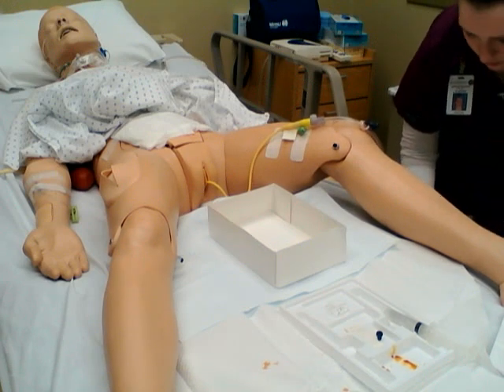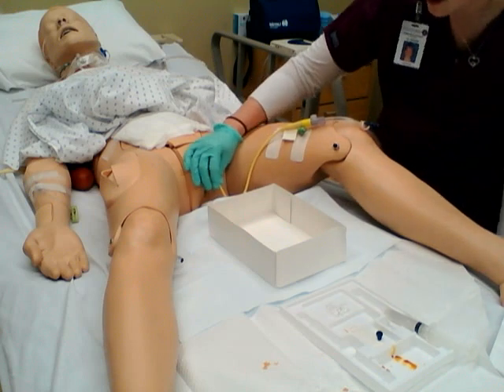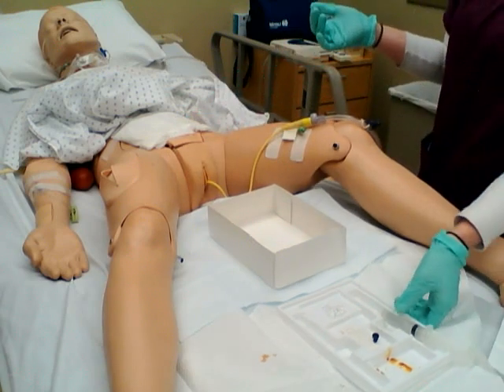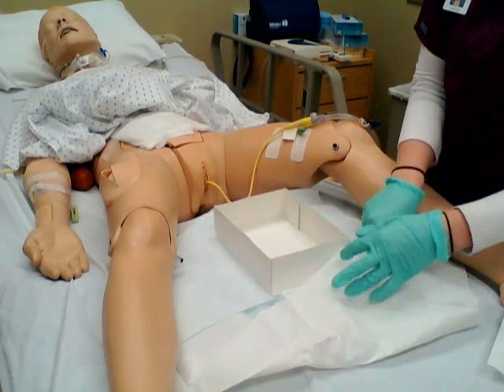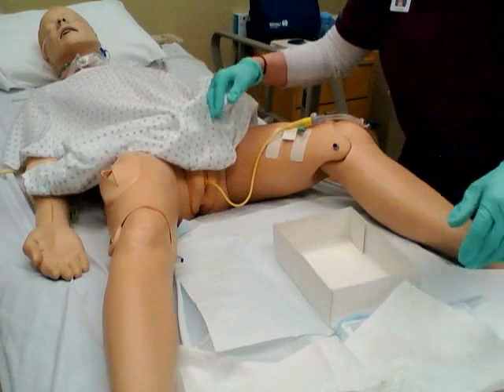And right after you fill that balloon, you would tug it a little bit as well, very gently, just to make sure that the catheter is going to stay in place and the patient isn't going to leak at all. So then once that's done, you can cover the patient and clean up your area.